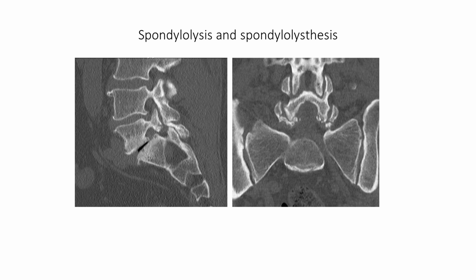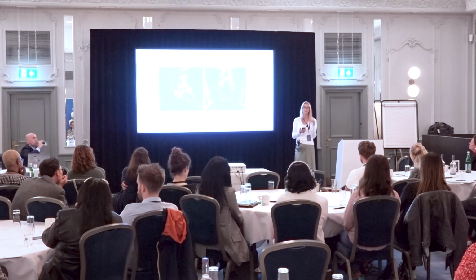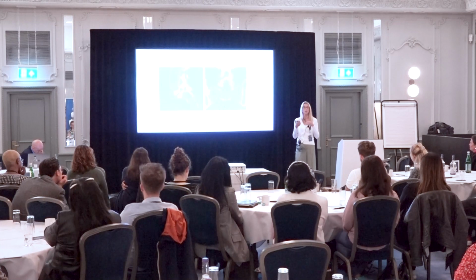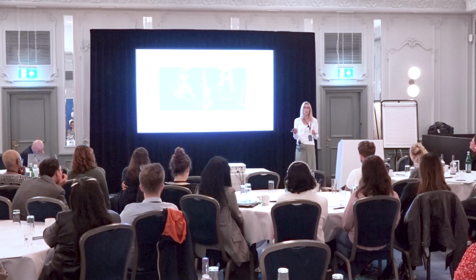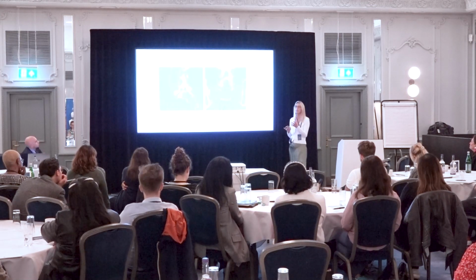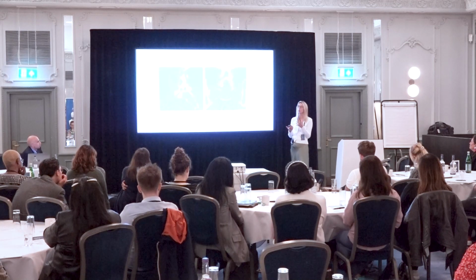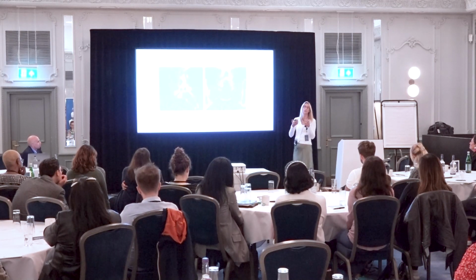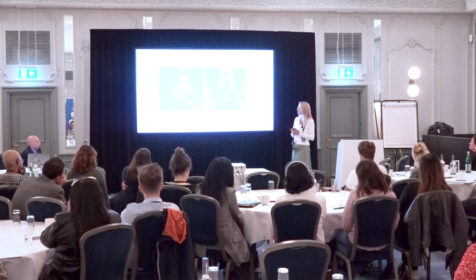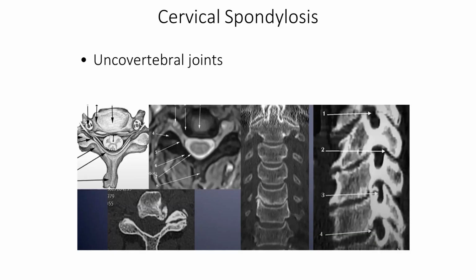So when the levels are slightly different from the standard 5 lumbar vertebrae or 12 thoracic vertebrae. Sometimes we only have 11 ribs, sometimes we have 13 ribs, and so often you get a transitional lumbosacral junction. It can then be difficult to label the levels, so on imaging, if we see that, we usually make a comment that there is a transitional level, and for the surgeons just to be very aware to check levels carefully when they operate. So that is the covering the lumbar spine.